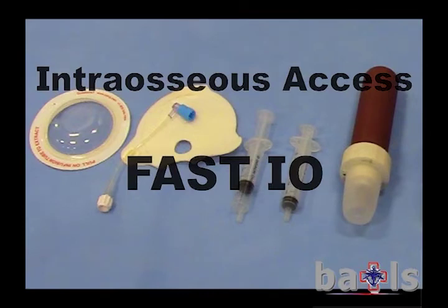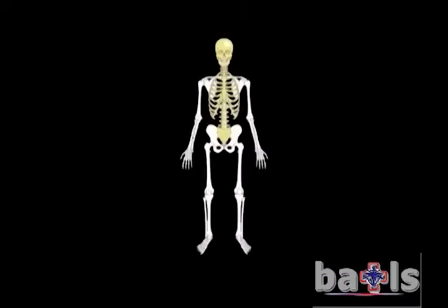This video covers intraosseous access and demonstrates the use of the FAST device. Practitioners use three sites for IO access: in order, they are the anterior medial aspect of the tibia using EZIO, the sternum using the FAST, and the head of the humerus using the EZIO.